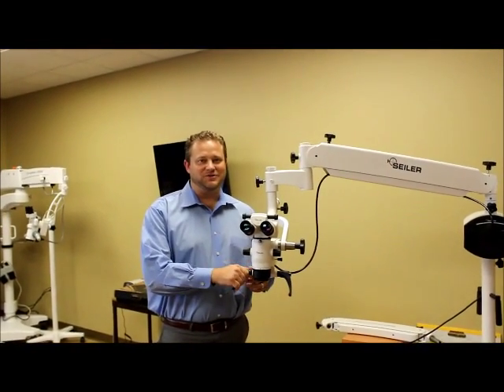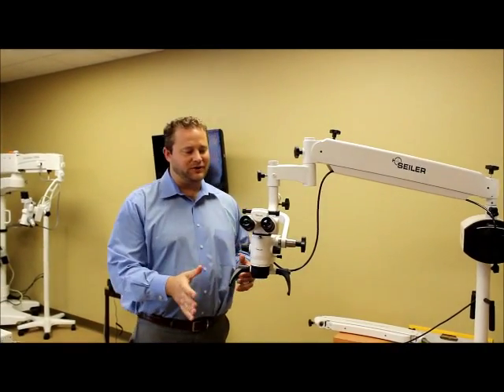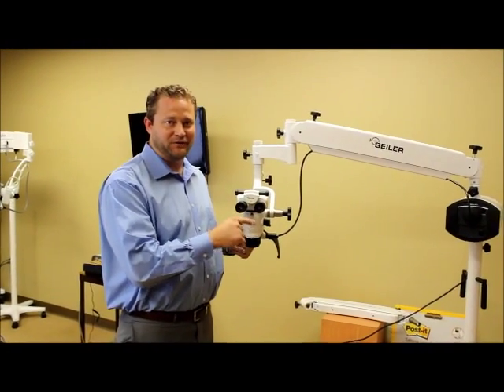Hi, I'm Dane Carlson, Division Manager over at Siler Microscopes. What I wanted to show everyone here briefly today was the addition of our new long panographic arm.